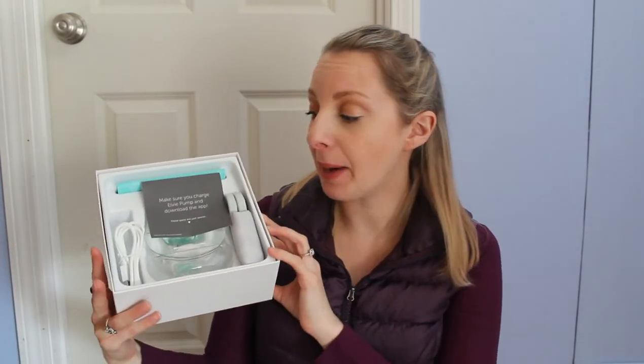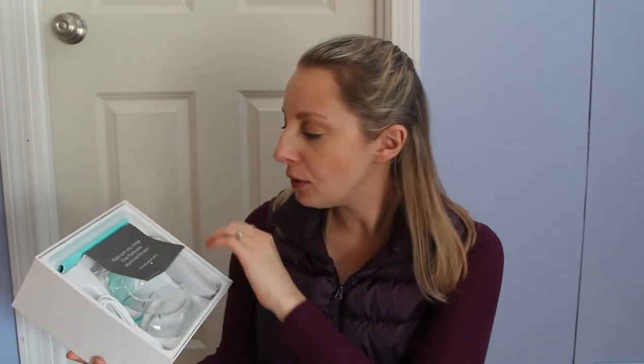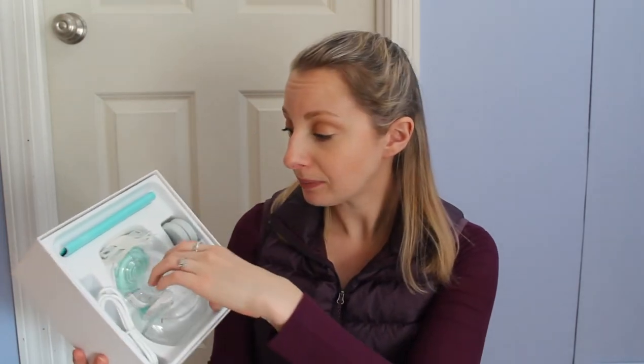Love the packaging — it's super minimal. There is a little note here that says make sure you charge the Elvie Pump and download the app. These parts are just spares. Oh my God — love that! They give you a spare, so you have a whole other pump set. Oh my gosh, so technically you do kind of have two. You could just buy the hub separately. It says: questions, contact our customer service team; press the bottle release button to separate it from the hub. So it looks like you literally have two collection bottles.